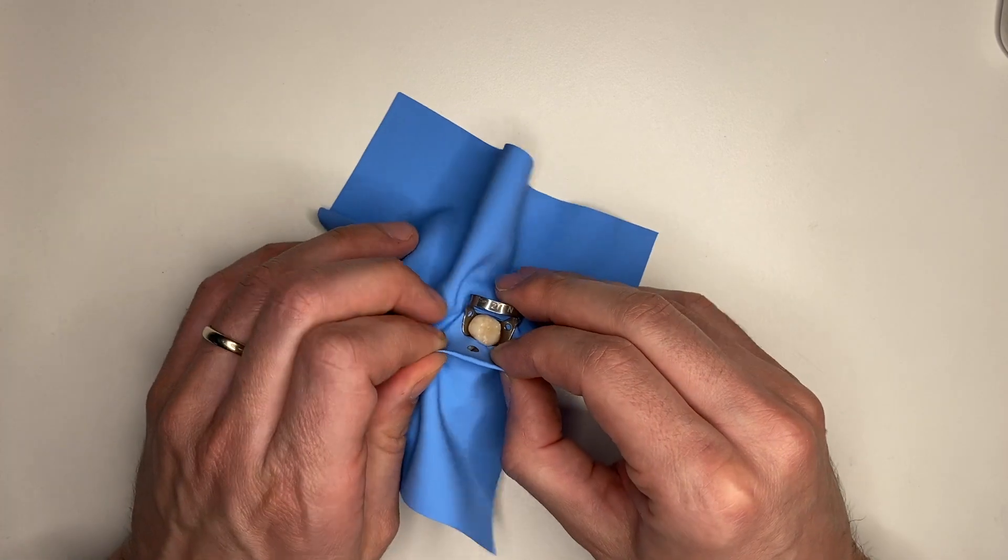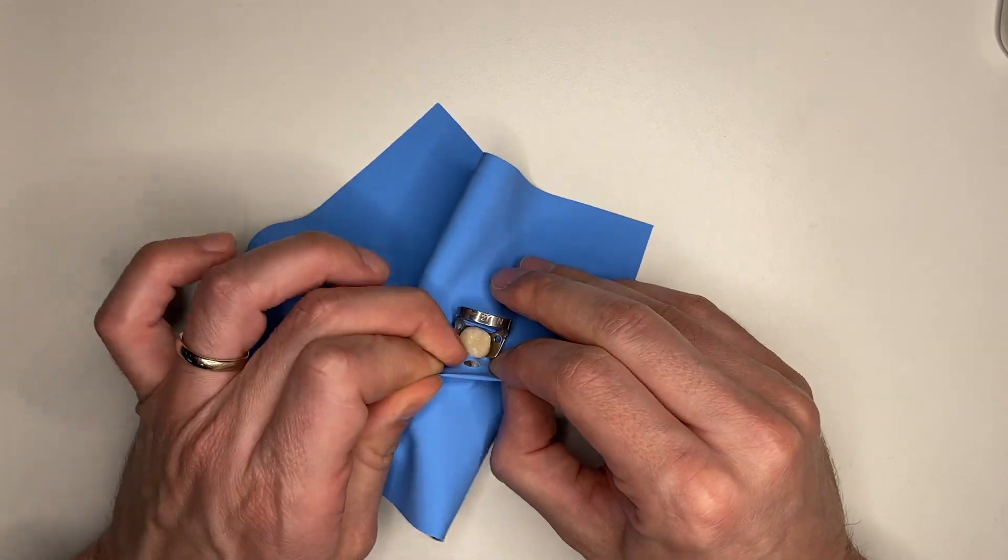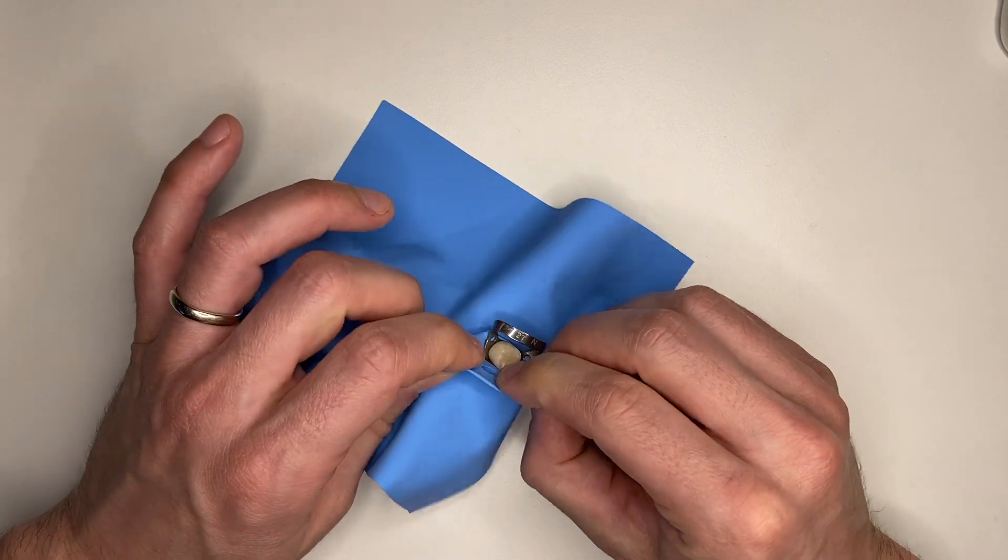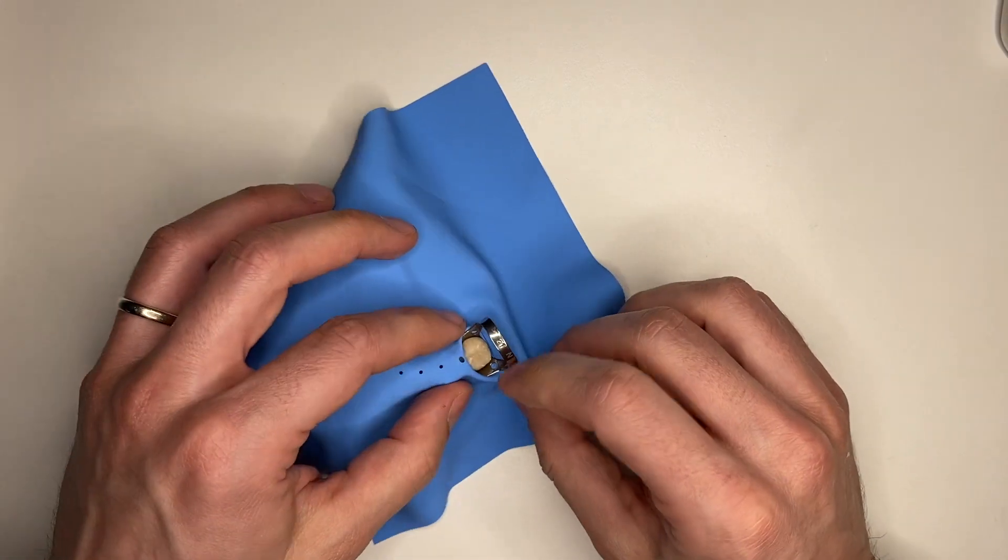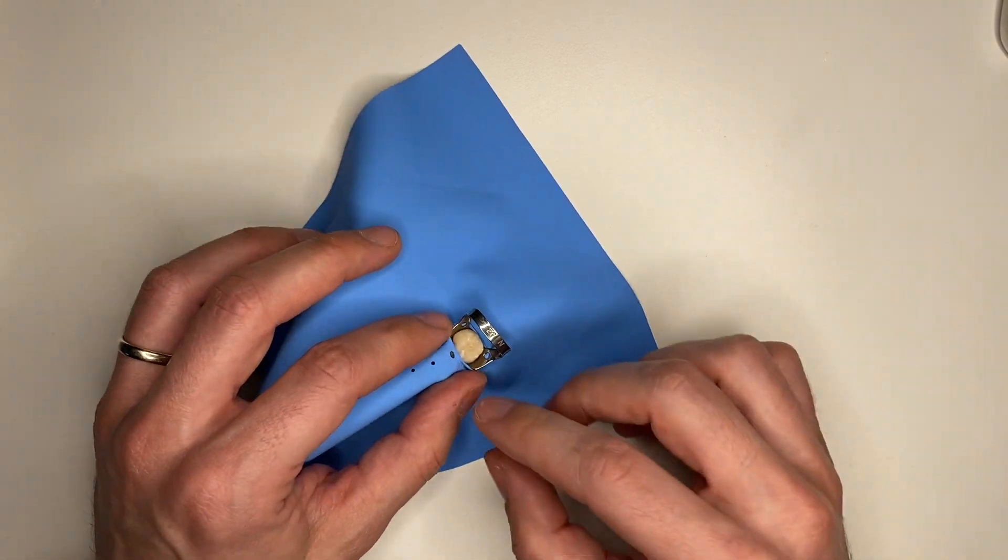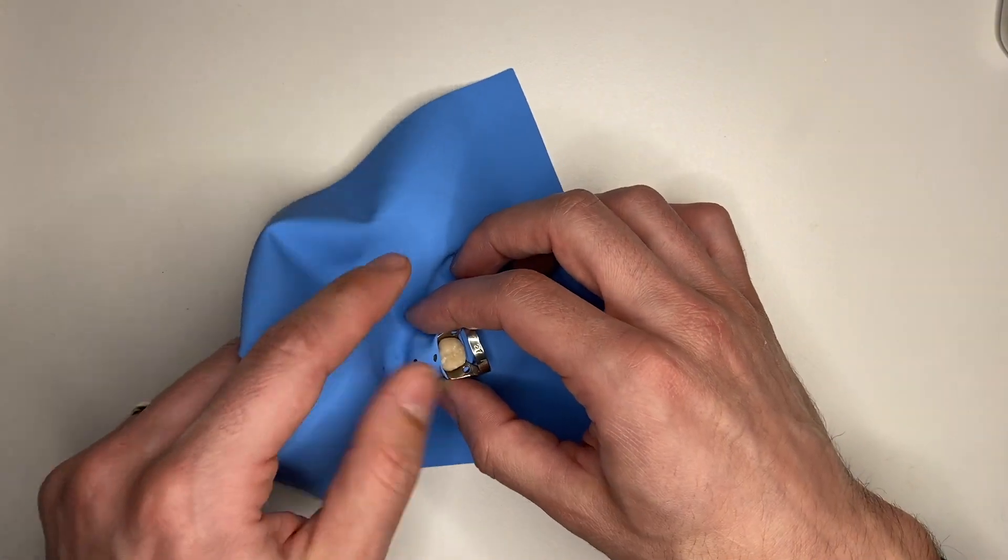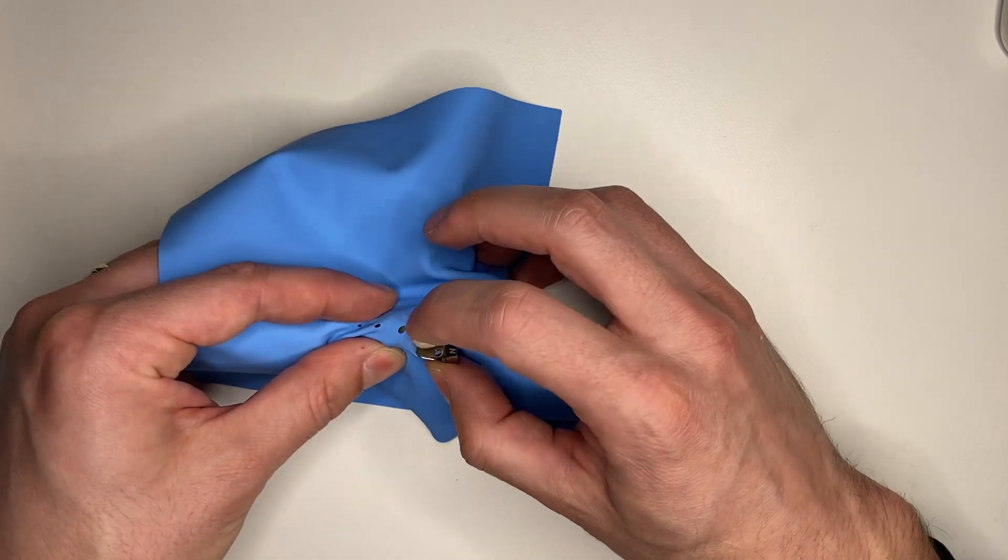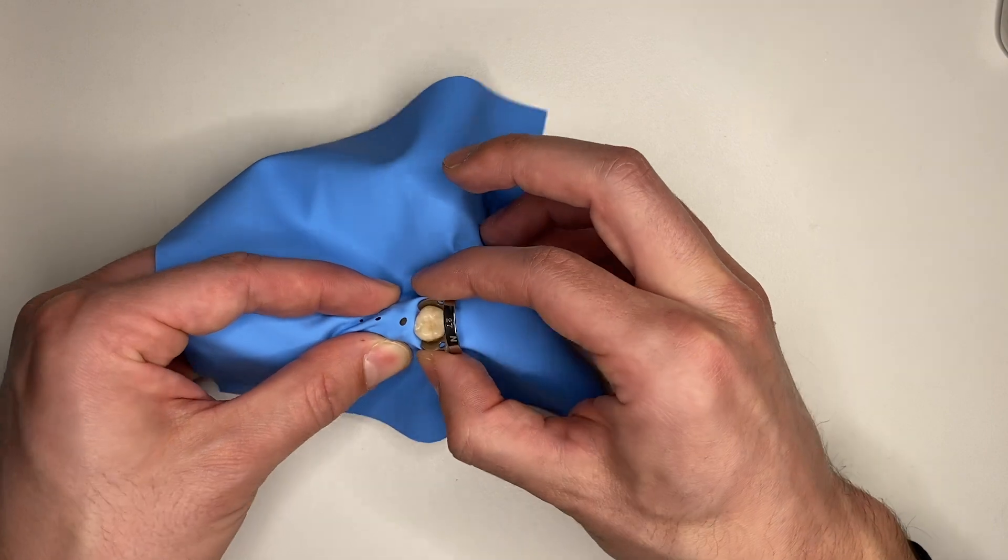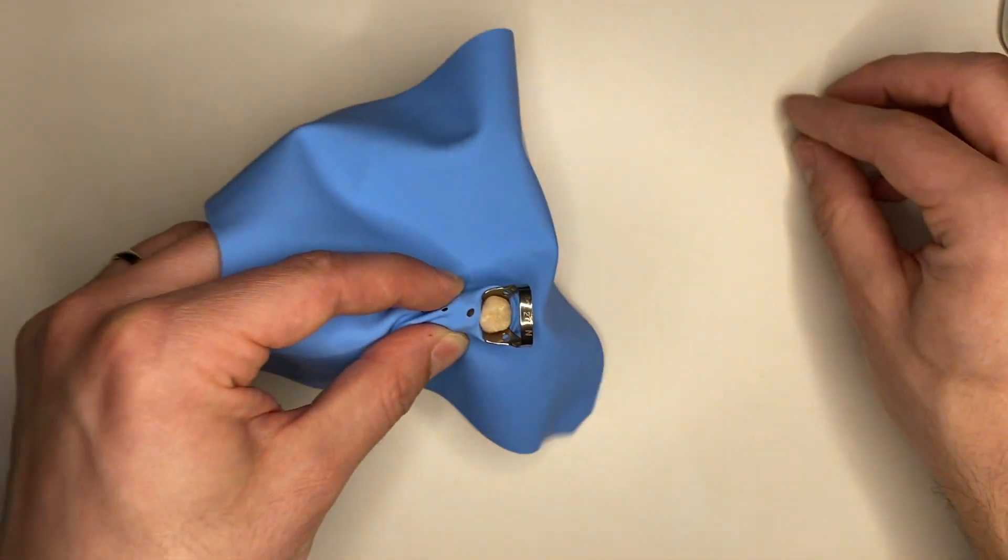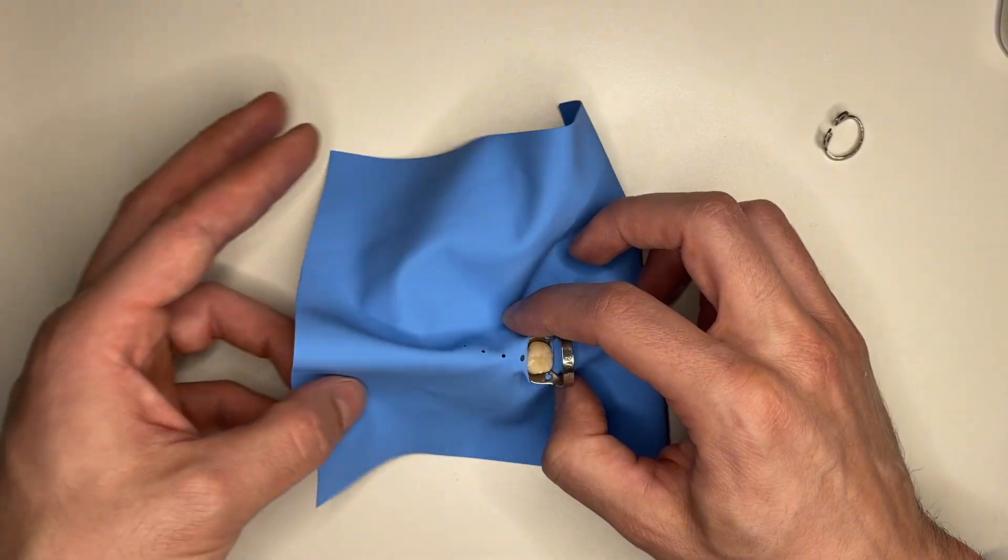Now what you'd like to do, because this is a heavy rubber dam, you want to make sure that it goes in the spaces between the teeth but it doesn't get forced through, because then you might tear the rubber dam. We are going to place one side of the hole in the space like this, and then we are going to use some floss to gently take the rubber dam through.